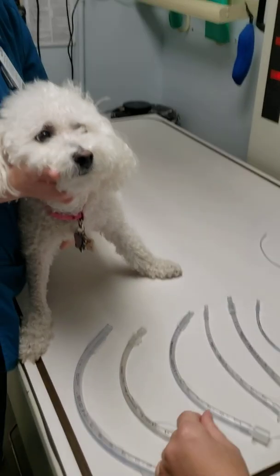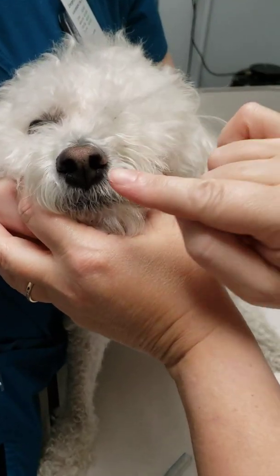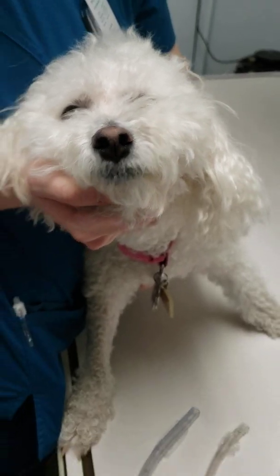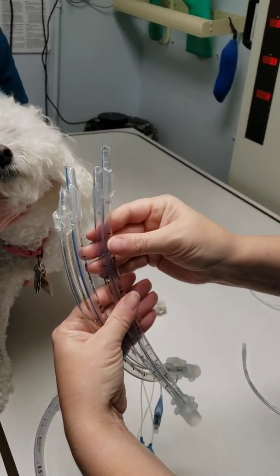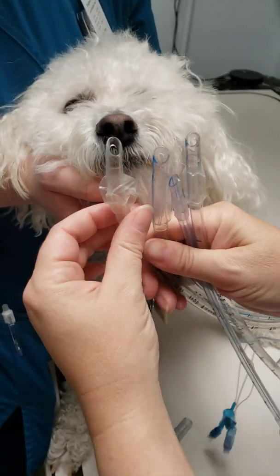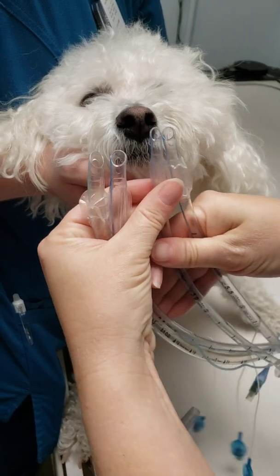I want to show you how you can check. You need to look at the size of the dog's nose — you need the nares and the distance between. I'm going to pick out four tubes that come close to what I think the size of the dog's endotracheal tube should be, look at this hole, compare it to the size of the dog's nares, and decide which one I like best.